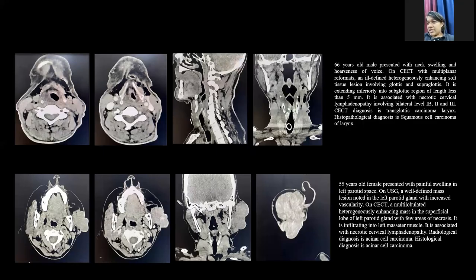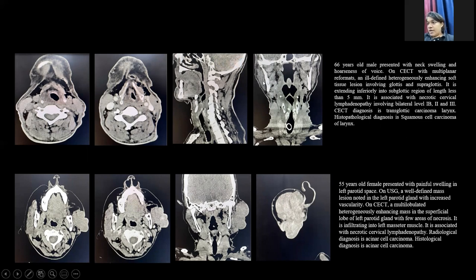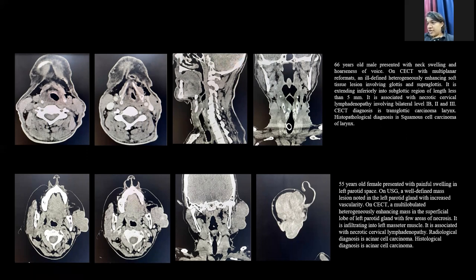I will now discuss the cases found in my study. The first row shows non-contrast images, followed by contrast images in axial, sagittal, and coronal reformats. In the first case, a 66-year-old male presented with neck swelling and hoarseness of voice. On CECT multiplanar reformats, we found an ill-defined heterogeneously enhancing soft tissue lesion involving the glottis and supraglottic region with mild extension into the subglottic region, associated with cervical lymphadenopathy. The diagnosis on CECT was transglottic carcinoma of the larynx, confirmed as squamous cell carcinoma on histopathology.